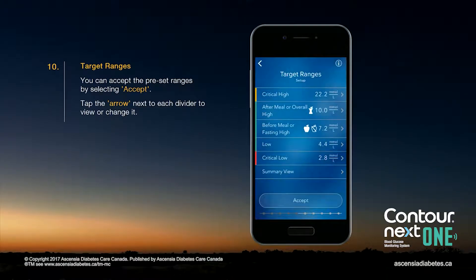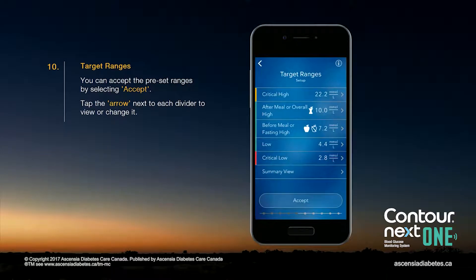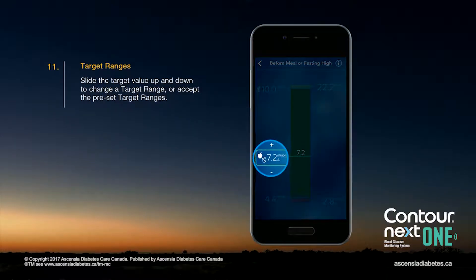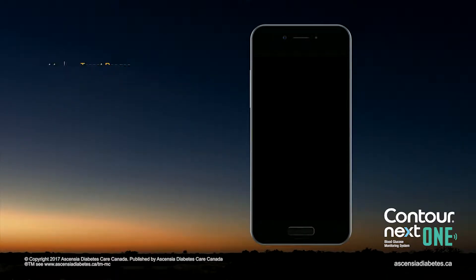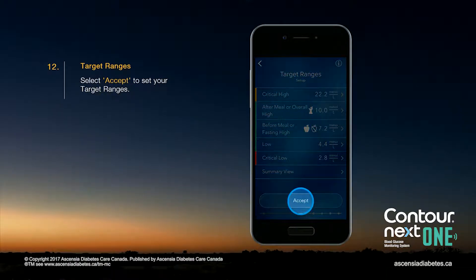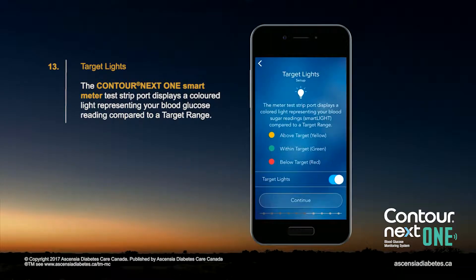You can accept the preset ranges by selecting Accept, or tap the arrow next to each divider to view or change it. Slide the target value up and down to change a target range or accept the preset target ranges. Select Accept to set your target ranges. The test strip port displays a colored light representing your blood glucose reading compared to a target range.